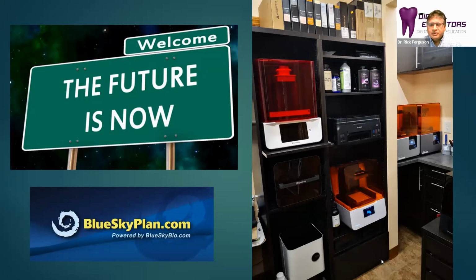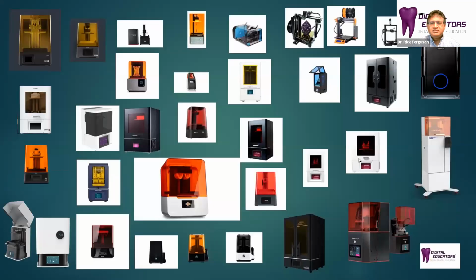This is an up-to-date photo showing our workhorse printers. I have several other printers. As a matter of fact, here is a partial list of all the printers that I've used and tested in the last 5 or 6 years or so. Some mostly dental, but some non-dental printers as well. And of course, we run the Facebook 3D printing group where we supply information to folks who are using all of these different printers. And it's a great place for sharing knowledge about 3D printing.